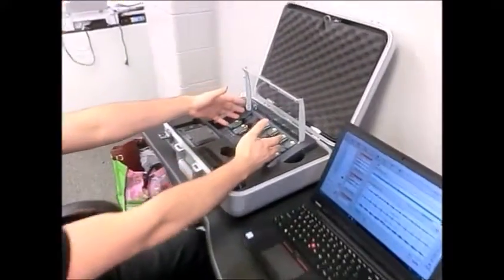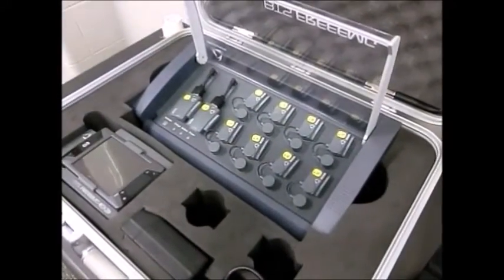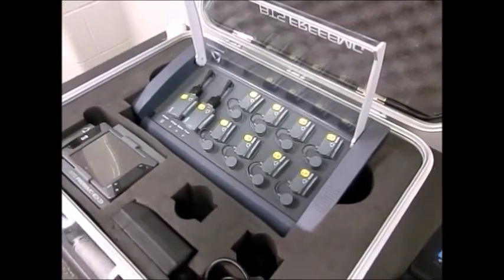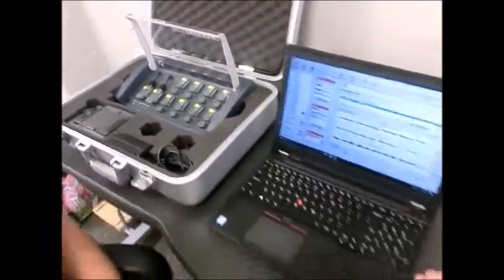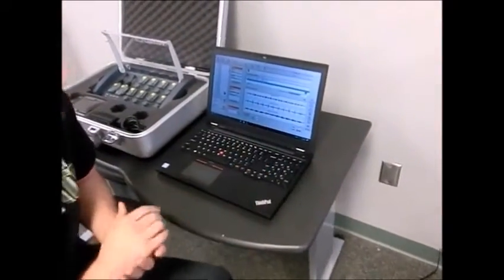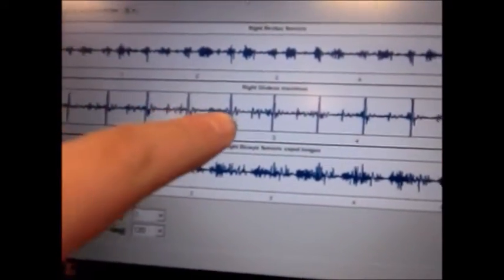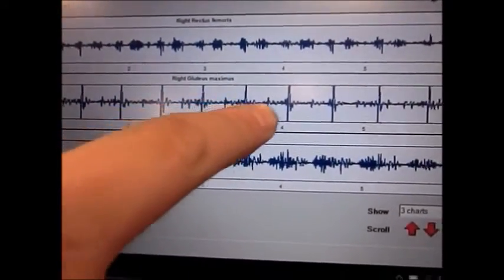So how we measure that is we use these electrodes right here to pick up that activity within the muscle through the skin. Those electrodes send that wirelessly to the computer here, where we pick that up and we see this nice squiggly lined activity. So what we see here is these little spikes. This is every time the muscle is active and moving the leg.